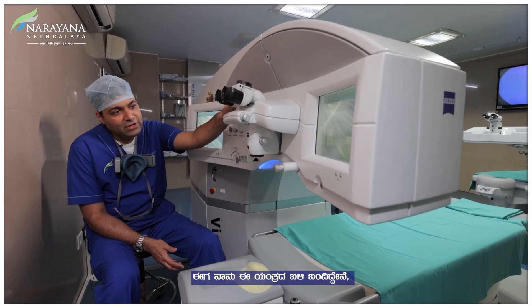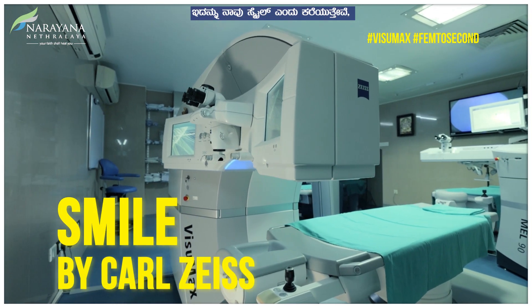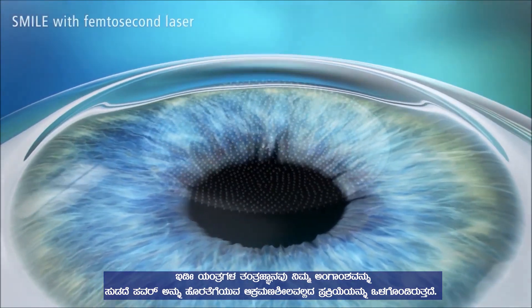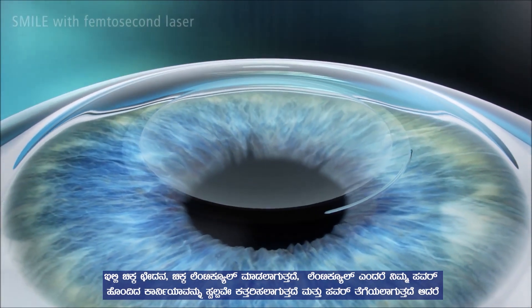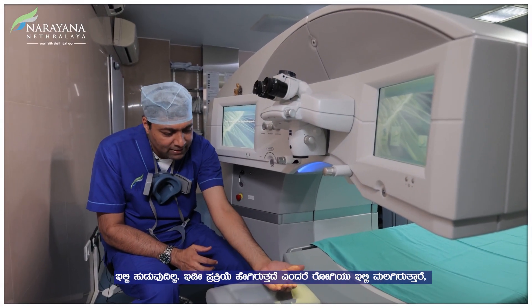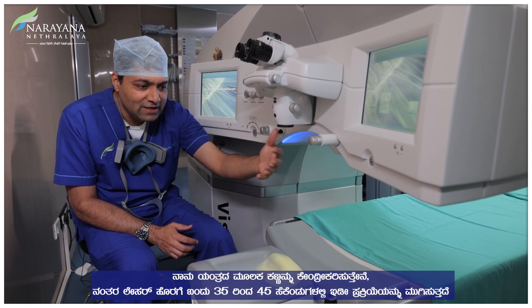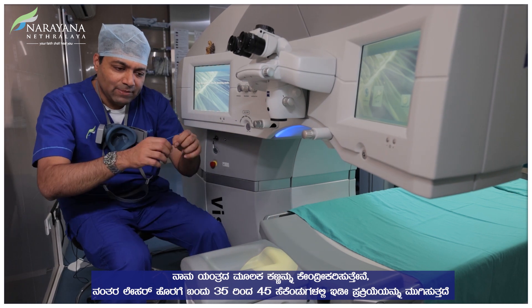Now I come to this machine — this is what we call SMILE. The whole machine's technology involves a very non-invasive process of taking the power out without actually burning your tissue. It's a small incision, a small lenticule — the lenticule is nothing but the small part of your cornea corresponding to your power which is cut, not burnt, and taken off. The whole process involves the patient lying down here, I focus the machine, and through this a laser comes in, and within 35-45 seconds the whole process is done.